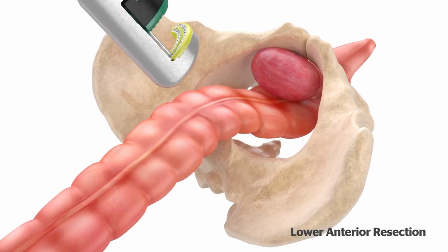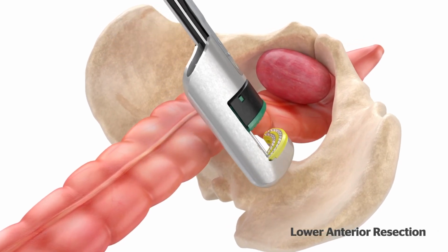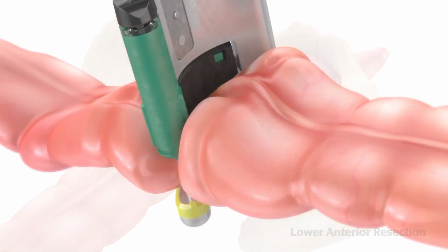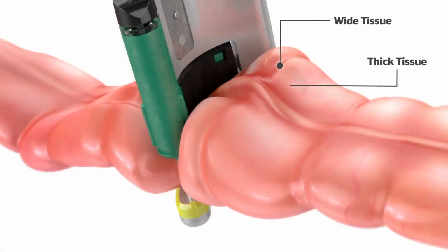During a procedure such as LAR, there may be times when it would be appropriate to do more than one firing for transection. Tissue that is wider, thicker, or difficult to close in the jaws of the device may indicate there is too much tissue to transect in a single firing.